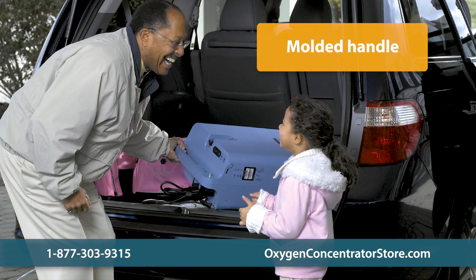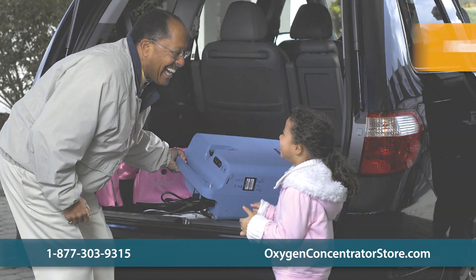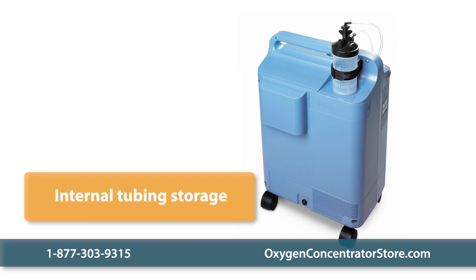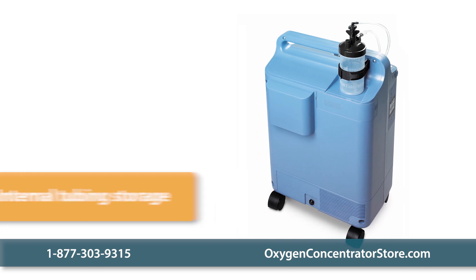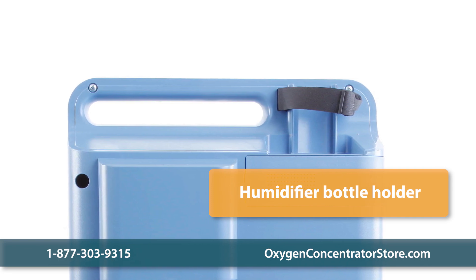The roomy molded handle and four wheels make the Everflow easy to transport, and internal tubing storage neatly keeps the humidifier bottle tubing available for whenever you need it. It also features a humidifier bottle holder that is compatible with all bottle styles.